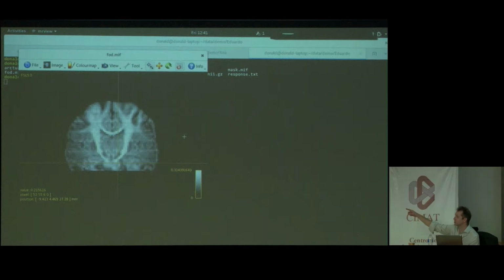From your data, I'm guessing you've used the Philips interleave. I don't know why. It's a weird thing that they have there. It's taken me a very long time to understand what that meant in Philips speak. On the Siemens, when you talk about interleaving, you're talking about evens and then odds. So I recommend you stick to Philips default, not interleaved, because that's probably related as well. And in your case, for example, I'm guessing you've got something like 64 slices.